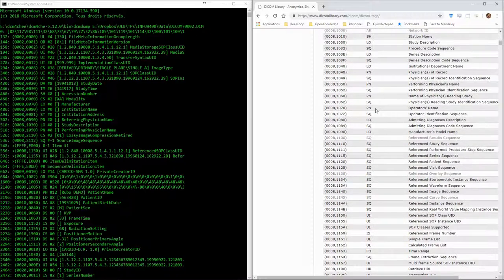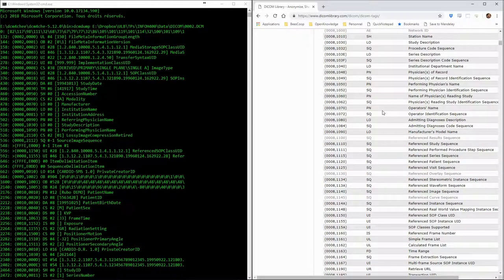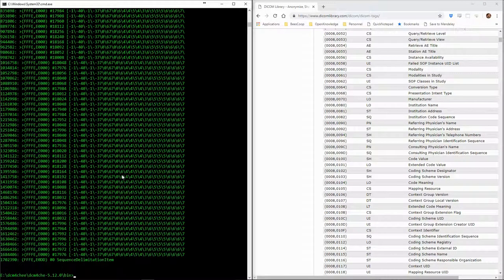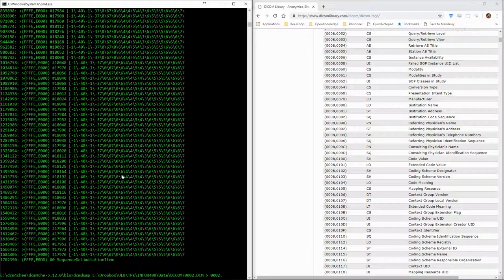We find the value of the tags within the square brackets. We can also dump the contents of the file to a text file rather than to the command prompt. This way we can afterwards read it in any text editor that we want.